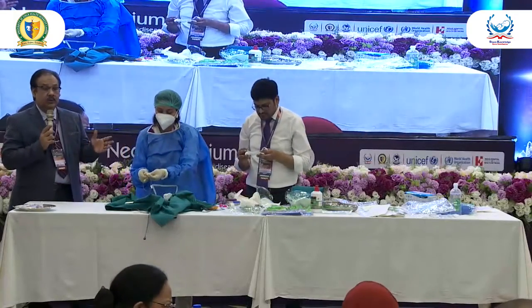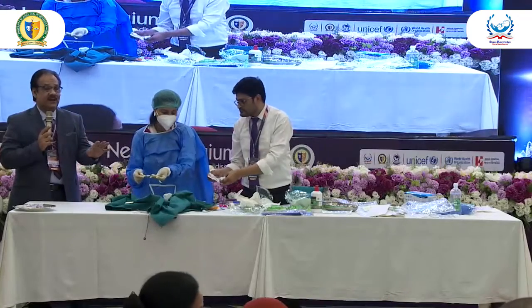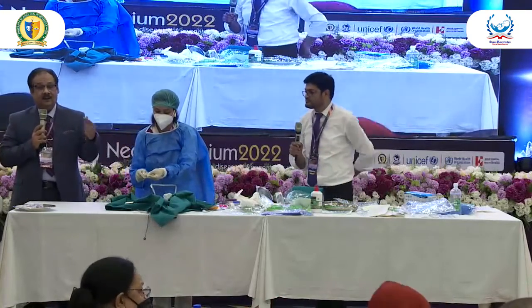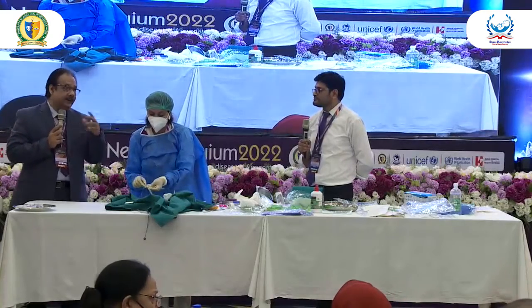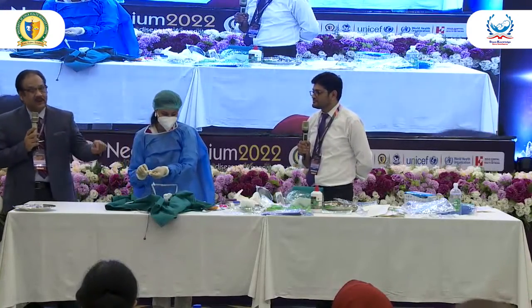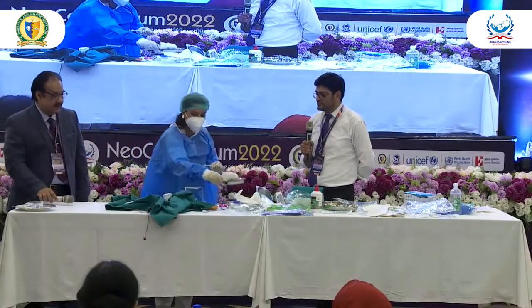As you can see, you have to flush the line. It's not only to heparinize, but to remove the air. Because if the air goes in, the patient goes out. So you have to flush the line.